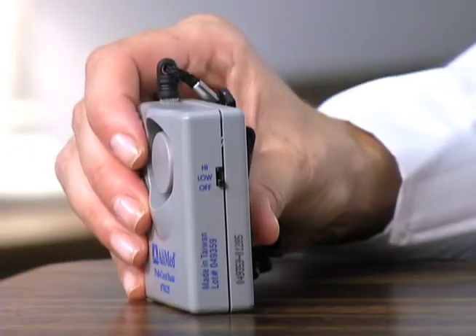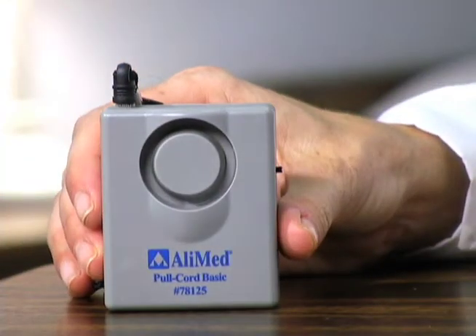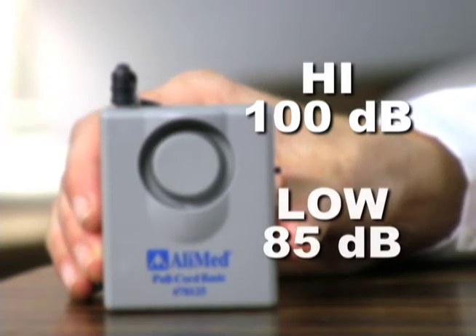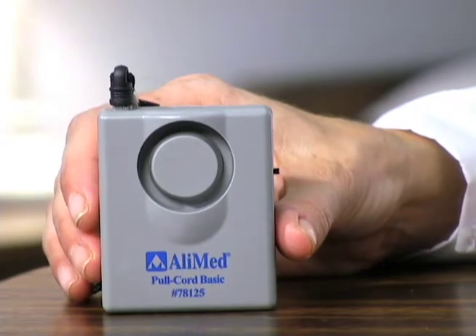To turn on the device, use the selector on the side to switch from off to either high or low. The high setting emits a 100 decibel alert, the low an 85 decibel alert. Be sure to test the alarm before use to ensure proper function.